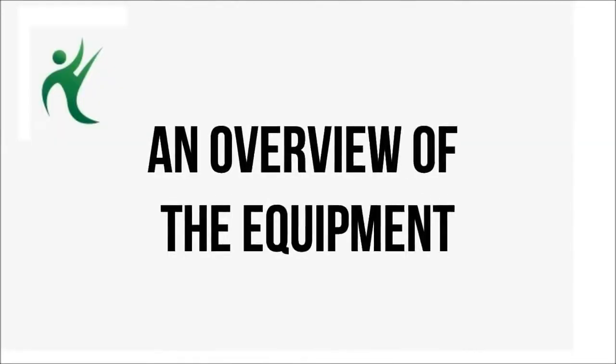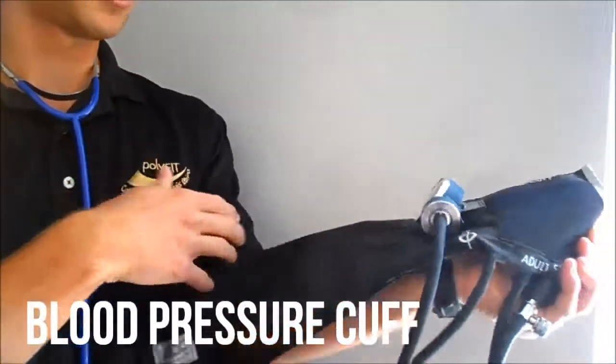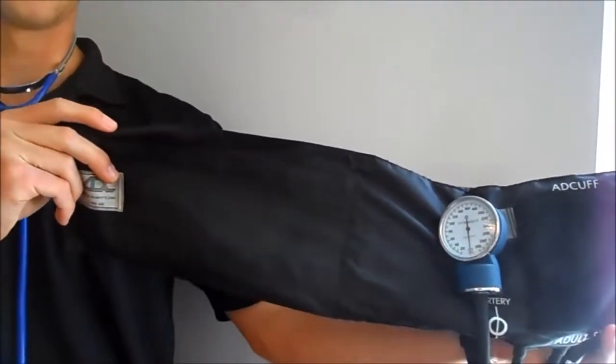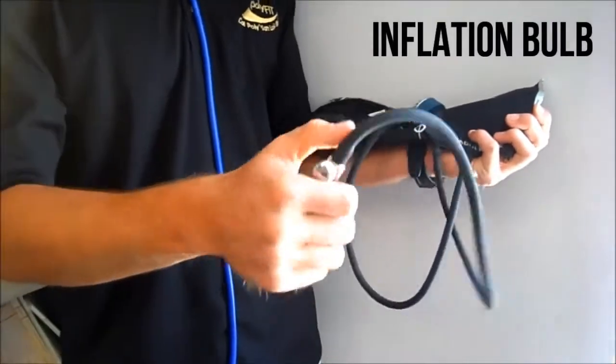All right, so after we take the heart rate, we move on to blood pressure. There's some equipment that you need to have prepared for this. This is the blood pressure cuff, and this whole black velcro thing is what you wrap around the patient's arm. You have the pump right here which allows you to pump up to put air in here, and that's what gets it tight around their arm.